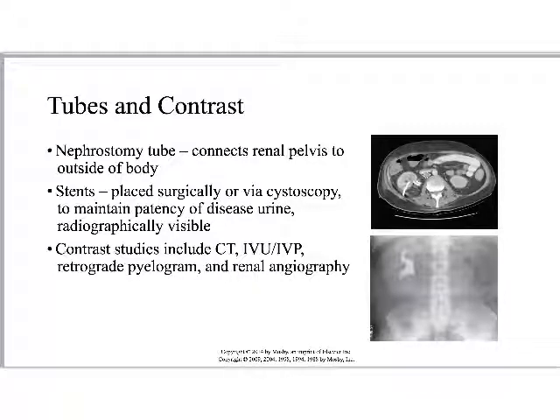Finally, renal angiography. This can be done in a number of different ways. We can do this with CT, we can do this with fluoro, but the point now is to not even look at any of the nephrons. We're just looking at the arteries. You know that you've got a good CT angiogram of the kidneys, especially on CT, if they're glowing like a light bulb.